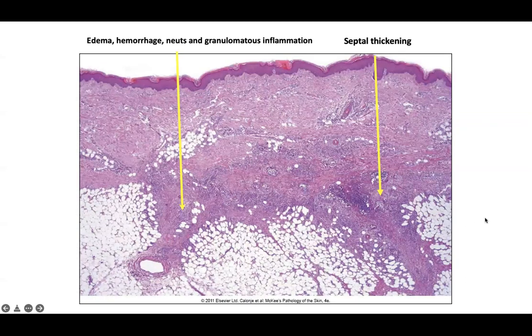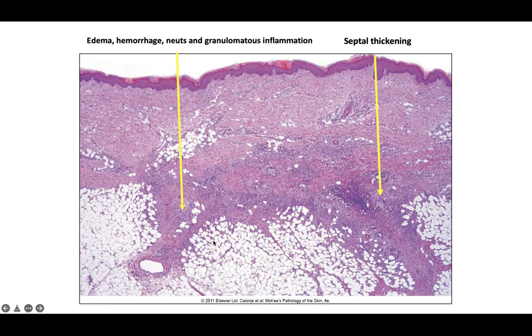At low power, you see septal thickening with lots of inflammation in a septal paniculitis pattern, as well as edema, hemorrhage, neutrophils, and granulomatous inflammation. You can see that the lobules are pretty clean and spared — you can actually see individual adipocytes. It doesn't mean that at the edges you don't have some lobular inflammation, but holistically it's primarily septal.